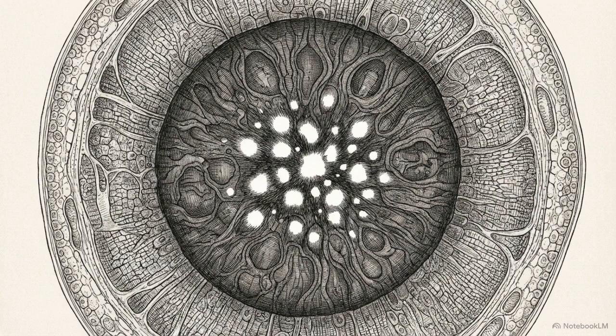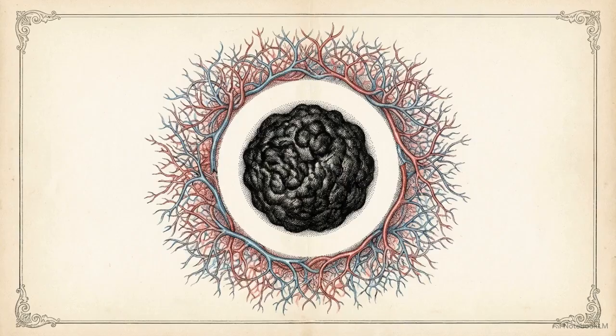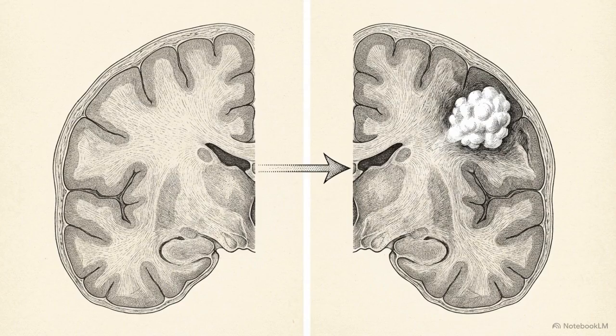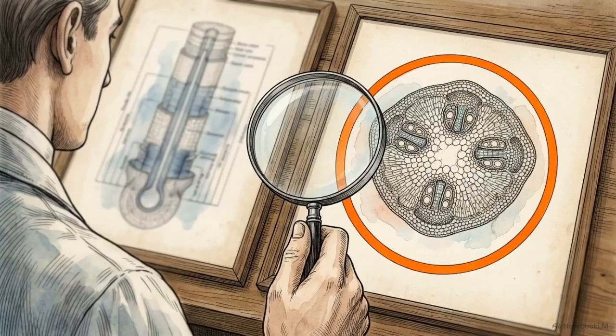Standard diagnostic criteria state that central or peripheral enhancement inside the ablation zone is never a normal finding. You may see benign peri-ablational enhancement. This should appear as a smooth and uniform ring around the periphery of the ablation zone. If the enhancement is scattered, nodular, or eccentric, it indicates the presence of residual tumor. Malignancy is suspected when there is an enhancement change of more than 10 Hounsfield units compared to the pre-contrast scan. Clinical management depends on prioritizing these enhancement patterns over the initial changes in lesion volume.